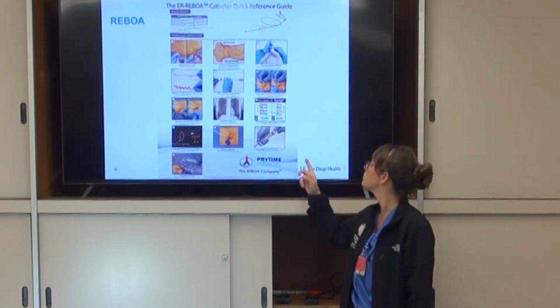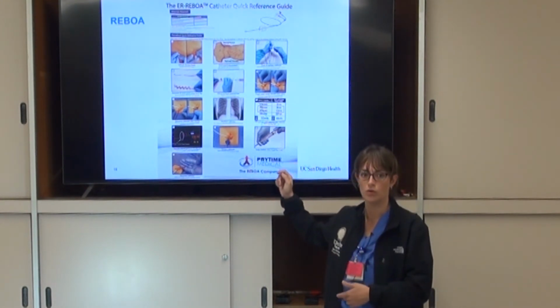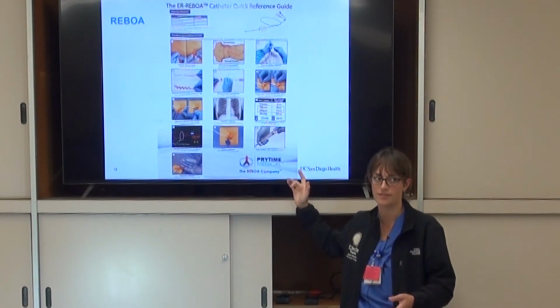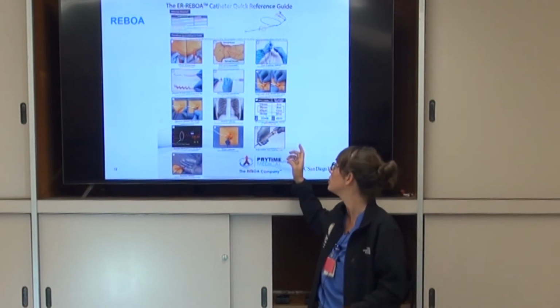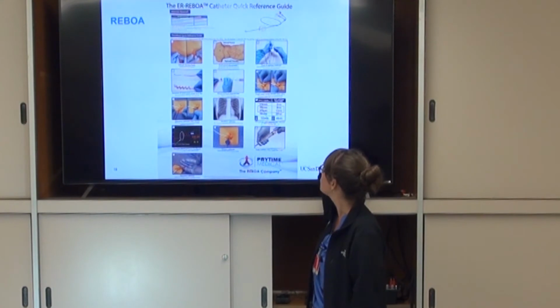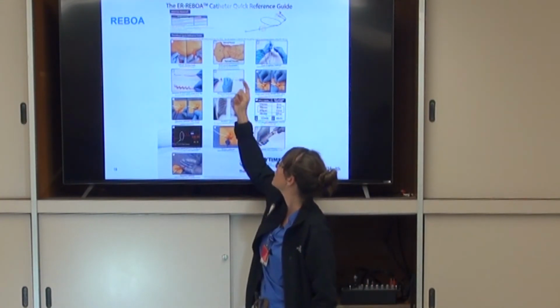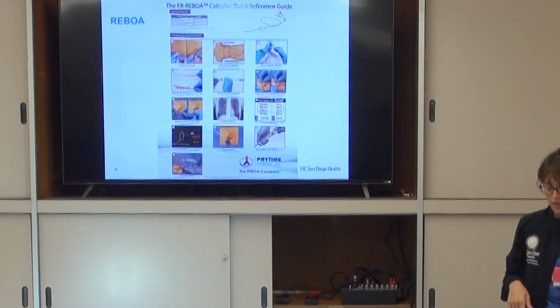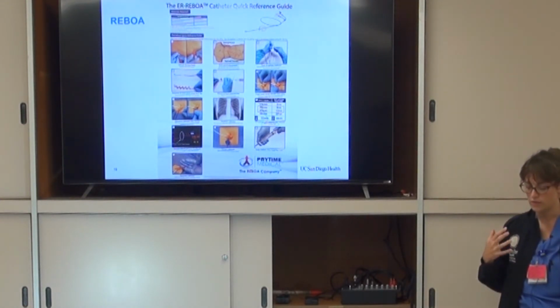I participated in placing one of these where we were low, right? And it results in actually pretty substantial trauma. You create a new defect in someone's vessel that wasn't there before. That's not good. So, this little tiny picture here. The locations, there are 3 zones that you can place it in. You'll go over it more in detail this afternoon.